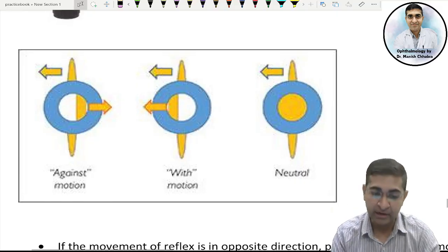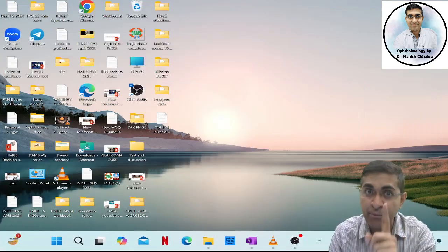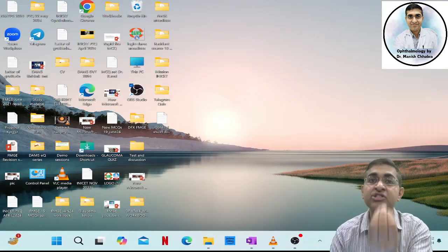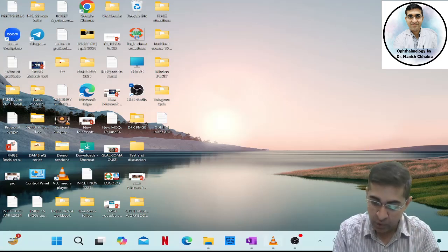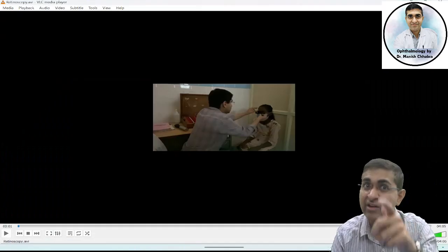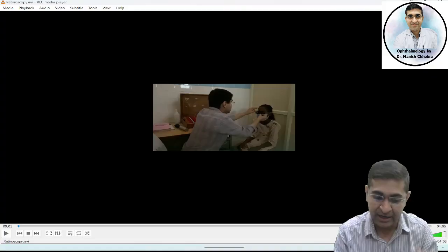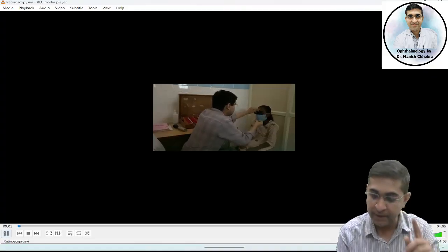Before I proceed further, it is very important for you to understand how it is done. I'm going to quickly show you the real patient video so that you have a feeling of sitting with me in my dark room and doing retinoscopy. So check this out. I am doing retinoscopy.